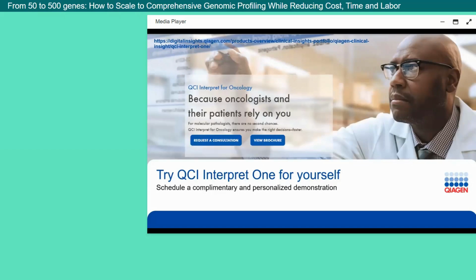Okay, great. The next question that we have is, is it possible to configure or customize the final report? Yeah, the report can be customized at two different levels. First of all, it's the content that goes onto the report. I think I showed you that you can edit the report content. That's up to you how you want to edit the content.